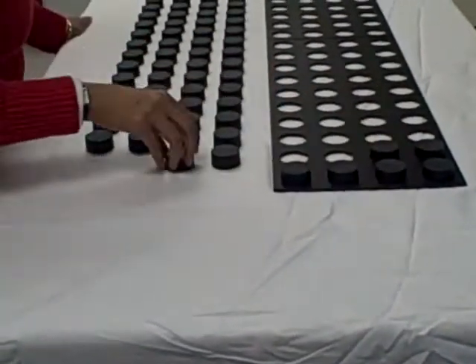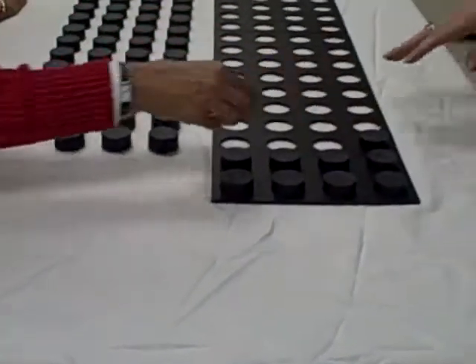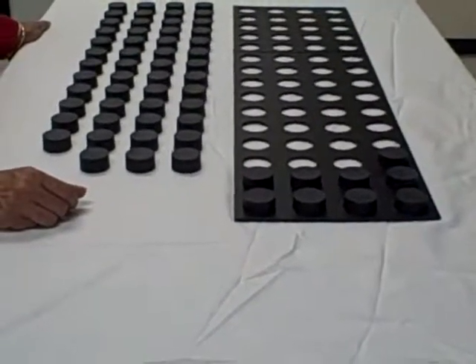So that's what you would do, and this is called the placing test, so we can go ahead and stop. And you would count how much time it took to do all of those.